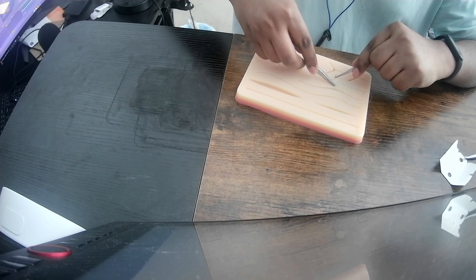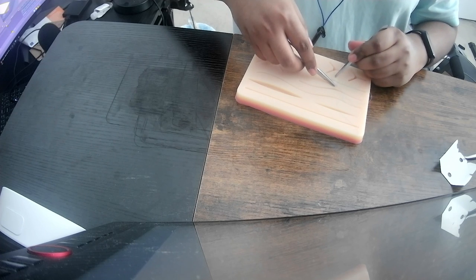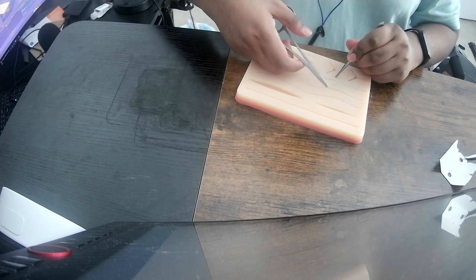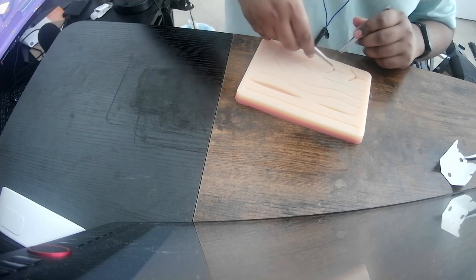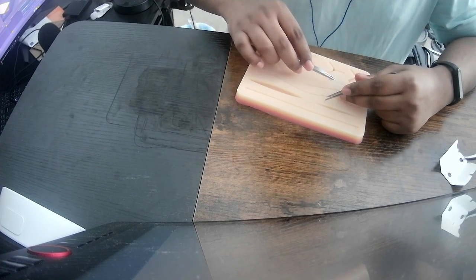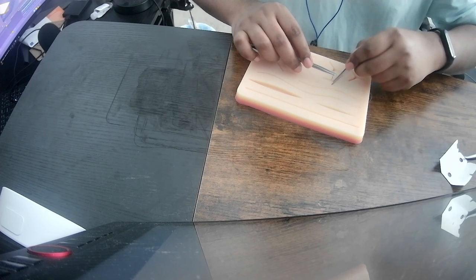Relying on muscle memory rather than just your vision is actually more reliable. Oops. Let's do it this way. Okay, I'm getting the hang of it. Definitely getting the hang of reloading the needle and the basic techniques, I guess. It's not looking that pretty, but again, for a first timer, I think it's pretty good.